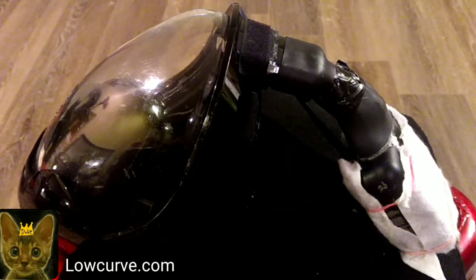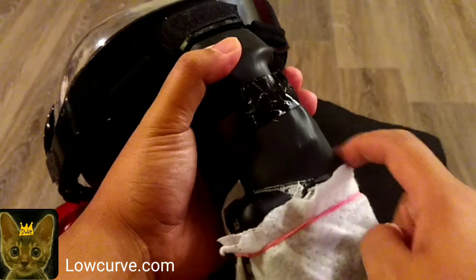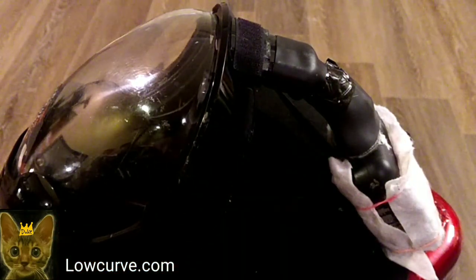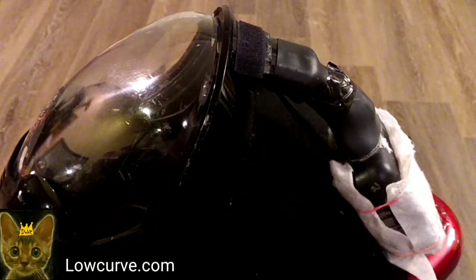So you notice that I tried to make this video in a completely different format than my usual tutorials, mainly because I feel like my videos have been too long and nobody really watches them all the way through. Also because I already finished this, I didn't want to pull it apart and redo it, because for one, the glue that I used to reinforce the seal here is really kind of messy. You can use any super glue for that connection. I just used this stuff, which sets in 30 seconds, so you can take your hands off of it and not have to prop it up for an extended period of time.